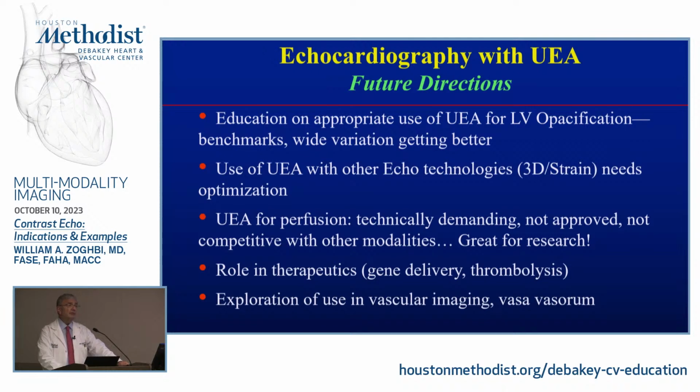part of the reason we do these is to educate people on how to use contrast echo, and believe me, we've been doing this since the inception of contrast. And it's good to see that although there is wide variation, it is better, and people are using it more appropriately. Please use it appropriately. And use with other technologies is still strained, I would say.